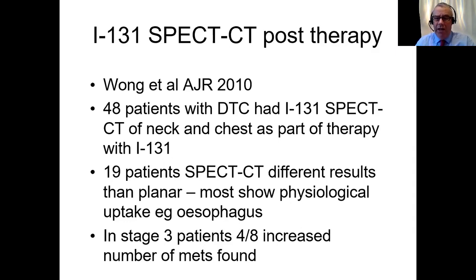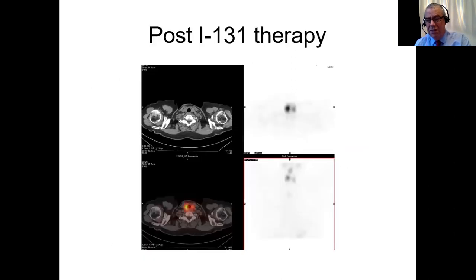So our friend Wong, again from the US, looked at SPECT-CT with post-therapy iodine-131 in 48 patients. And they found that in 19 patients, the SPECT-CT really helped, particularly in showing uptake was physiological, not pathological. But in more advanced patients, it found additional sites of disease.